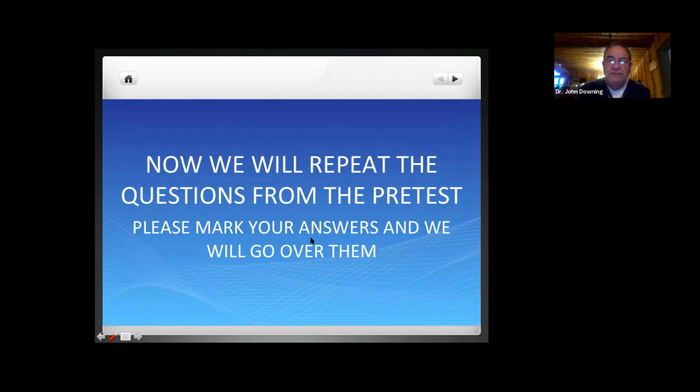Okay, well, we have some questions now. Okay, in case of persistent capsular cortical adhesions, how do you make a safe hydrodissection? I think the very most useful technique I have found in those is to do the tangential hydrodissection, where you go around under the capsule, sweep around on one side as you're injecting, and do the same thing on the other side. Then again, decompress, pushing back, and if you do that 2 or 3 times, almost always you will free up the lens.